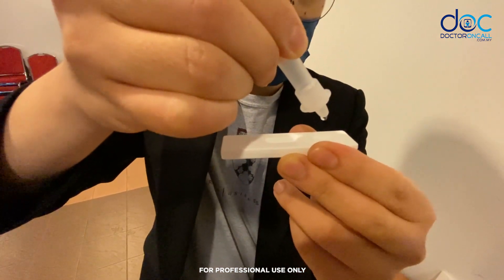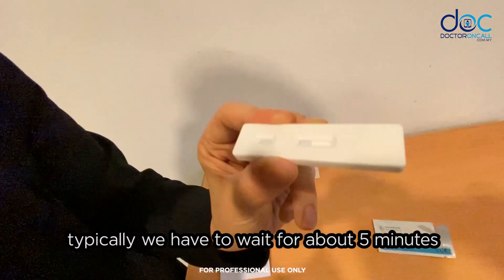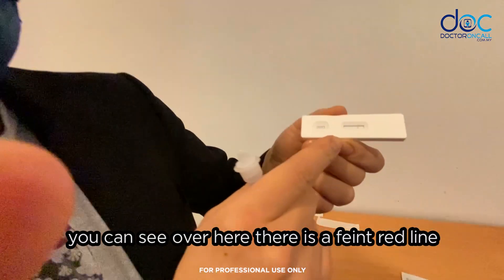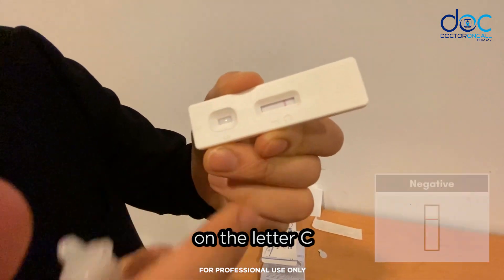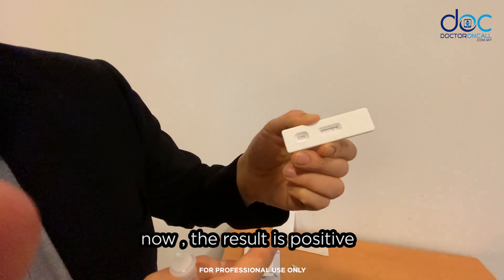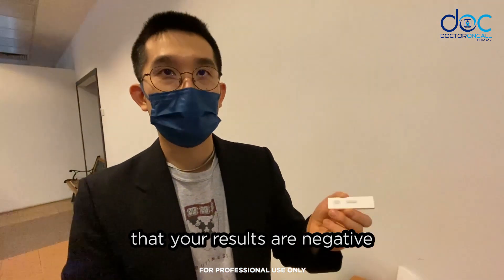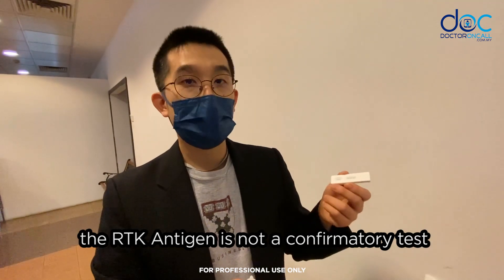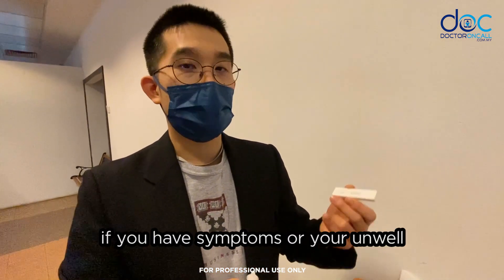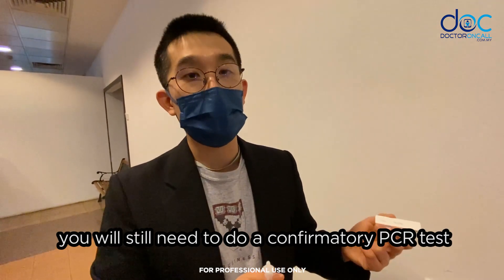Drop three drops of the mixture onto the panel of the cassette — one, two, three. We have to wait about five minutes before reading the results. You can see a faint red line on the letter C, which stands for control, meaning the result is negative. The result is positive if you see two red lines, one at C and one at T. It's important to note that the RTK antigen is not a confirmatory test — if you have symptoms, feel unwell, or test positive, you will still need to do a confirmatory PCR test.